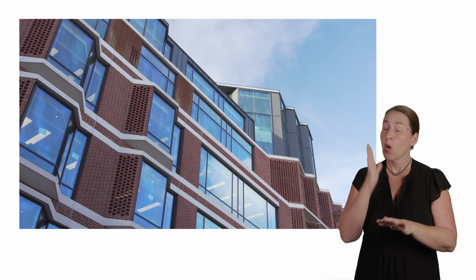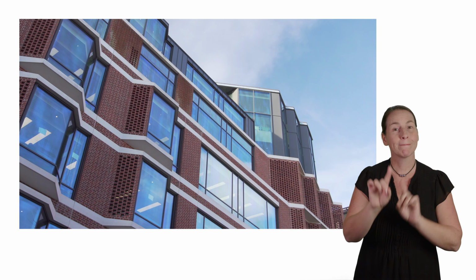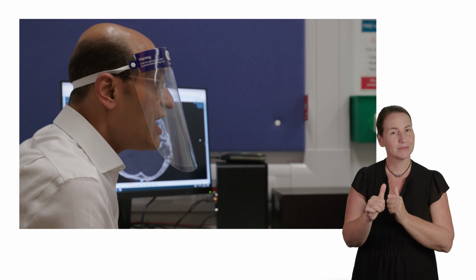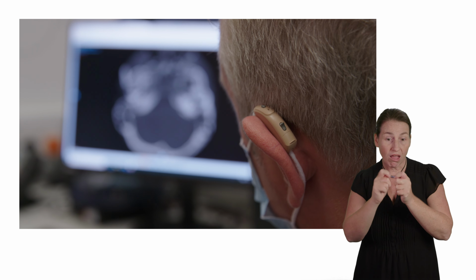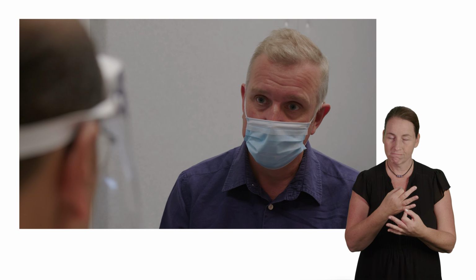After you've completed your assessment, all the results will be discussed in a multidisciplinary team meeting, and we come out with a recommendation whether we think a cochlear implant would be suitable for you or a different type of implant would be more suitable. We might find that simply adjusting your hearing aids might be the solution for your hearing problem. But at the same time, you will need to make your own mind up about whether this is something that you'd like to go ahead with. So it's quite a big commitment from you yourself.